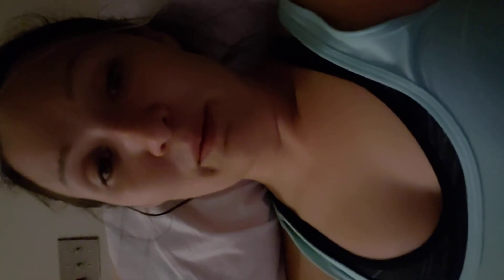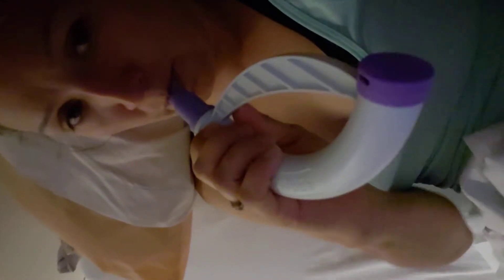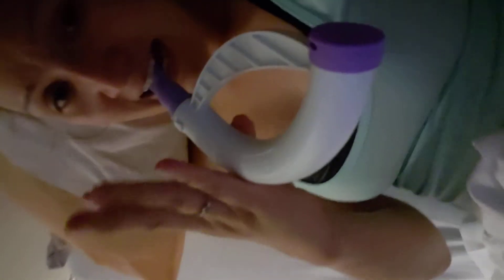My respiratory therapist told me to ask for the flutter valve. This one is for when you exhale. When I exhale, that's when I'm having a lot of problems, so I started doing both devices. You basically take a deep breath and then exhale into the flutter valve. You can twist it to make it more difficult or easier depending on your level. You just have to pay attention to your body and hold it however it needs to go into your mouth. Ten times an hour.